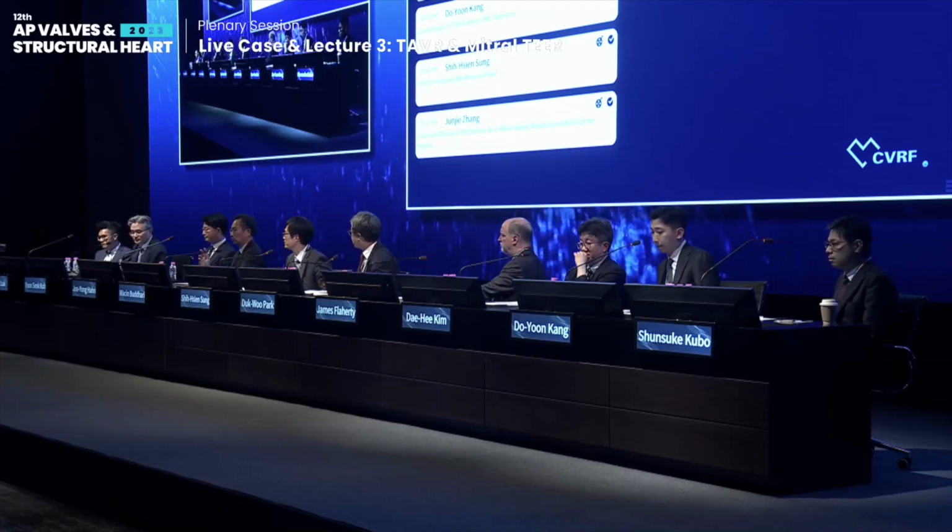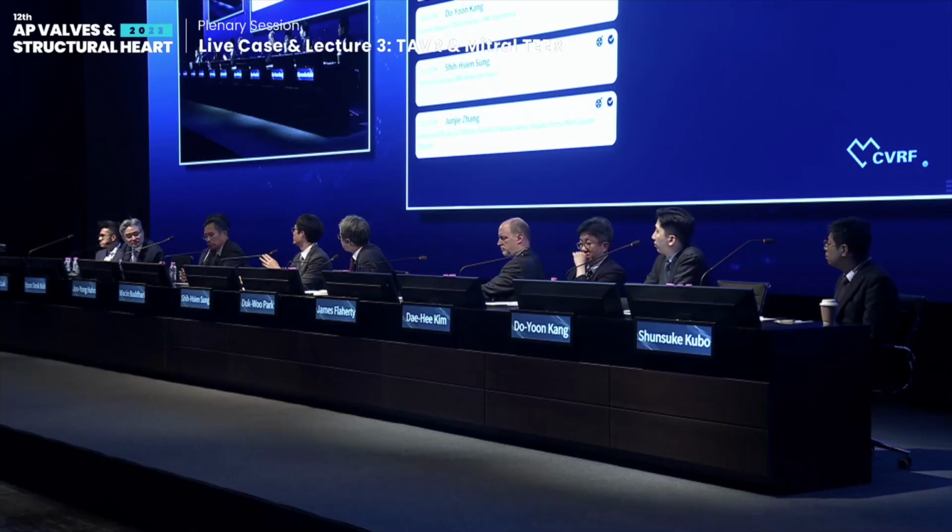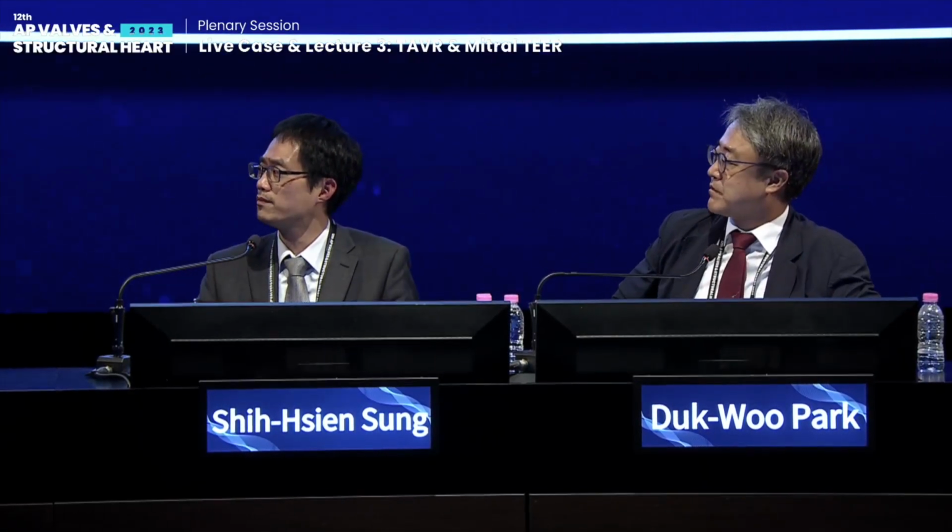I think the TR reduction might also be related to the annulus, whether the tricuspid annulus is dilated or not. Given that almost all patients can get improvement in pulmonary pressure, the TR might really be improved in patients who do not have a dilated annulus. But for patients who already have a dilated annulus, probably not.